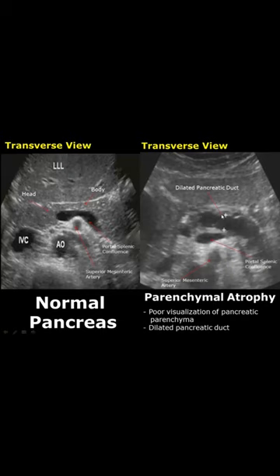We also see a dilated pancreatic duct. The diameter of this pancreatic duct is definitely more than 3 millimeters.